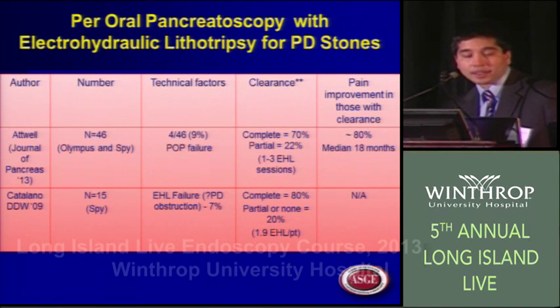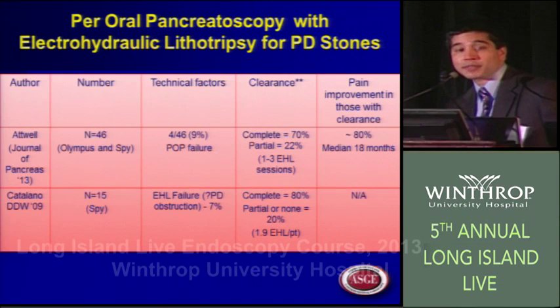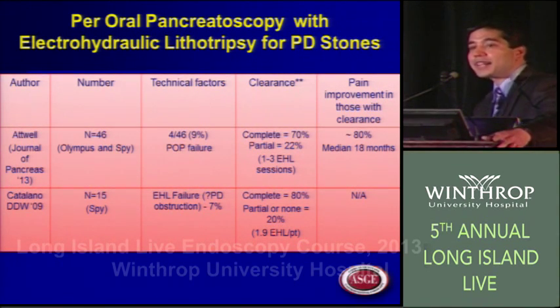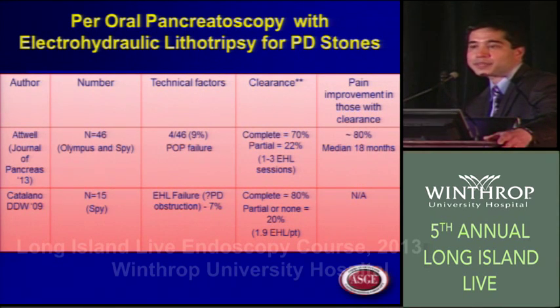Our data on this is in about 50 patients, published this year, actually in press, in Pancreas. There are some technical failures that are related to downstream strictures of pancreatic duct stones. Most of the literature, when they talk about calcific pancreatic stones, will utilize SWL, extracorporeal shockwave lithotripsy. One of the reasons we utilize pancreatoscopy and intraductal lithotripsy as a primary setting is because SWL generally does not obviate the need for ERCP.